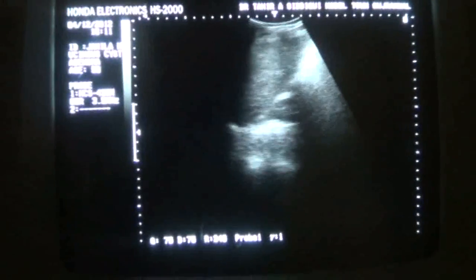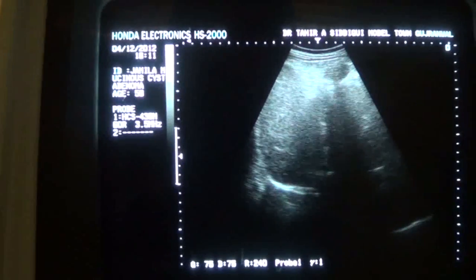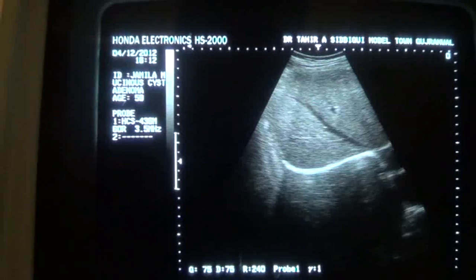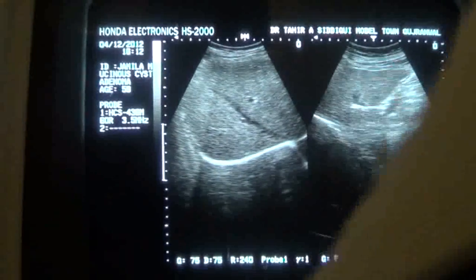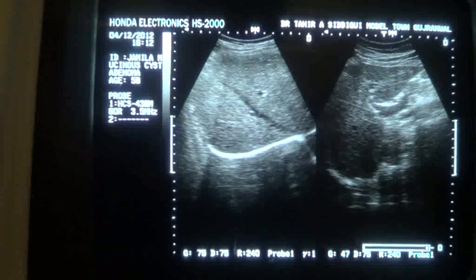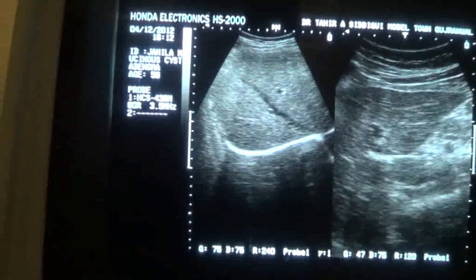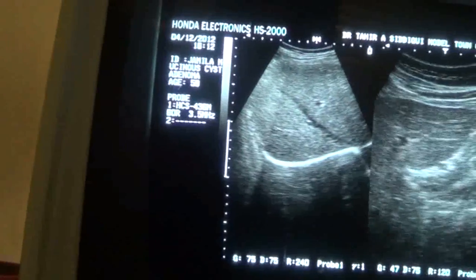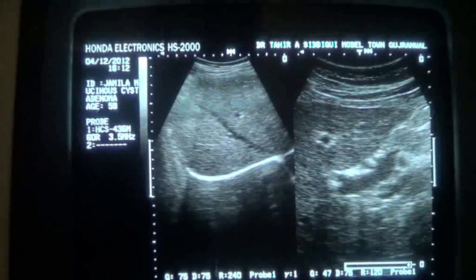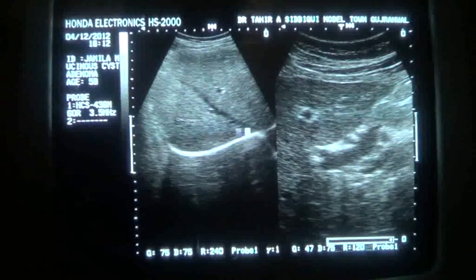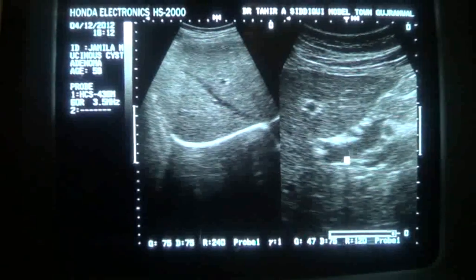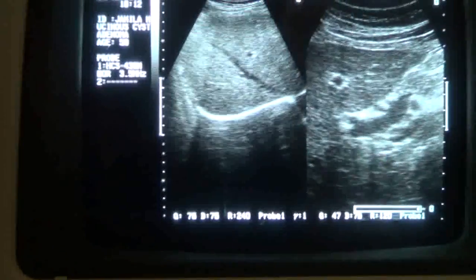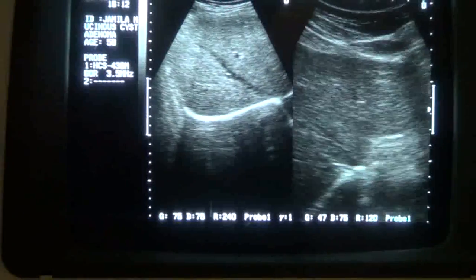Is there any focal lesion within the liver? This is the right lobe of the liver and this is the left lobe. I will concentrate on the left lobe. This is the liver, this is the middle hepatic vein, this is the left lobe of the liver, the portal vein, and the region of the portal hepatis. No focal lesion relating to the liver.